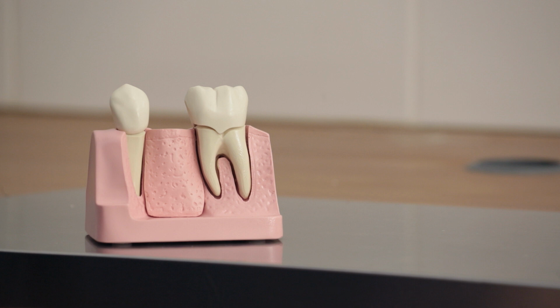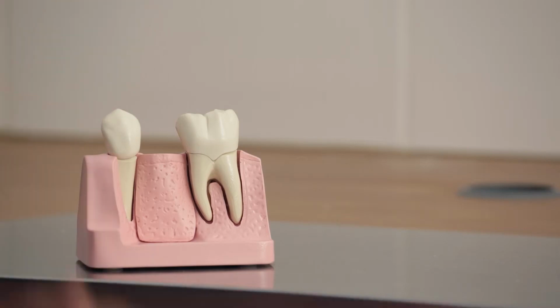The first option that we can consider is something removable, which is relatively simple and quite straightforward to make. It's in the form of a denture. It can be used to replace that missing tooth. The main disadvantage with the denture is that it is removable, so it can sometimes be a little bit uncomfortable and a bit annoying because it doesn't feel like a natural tooth, given that it's not fixed to the adjacent teeth or to the jawbone.